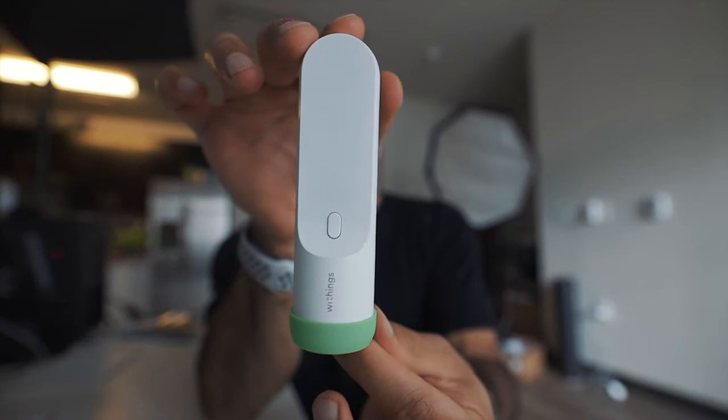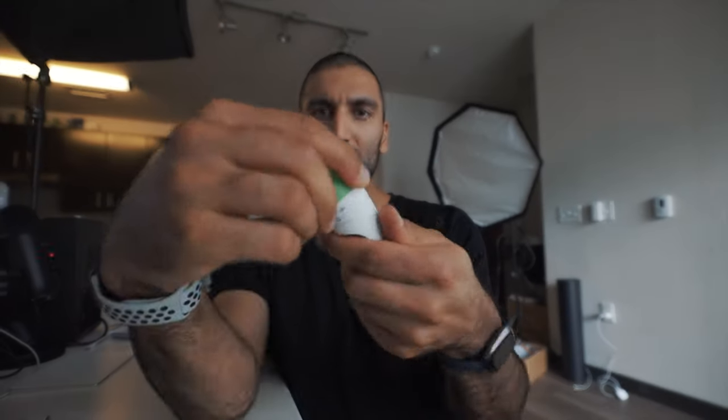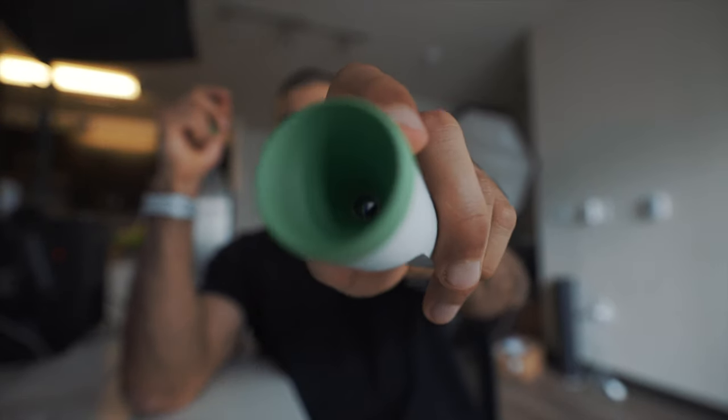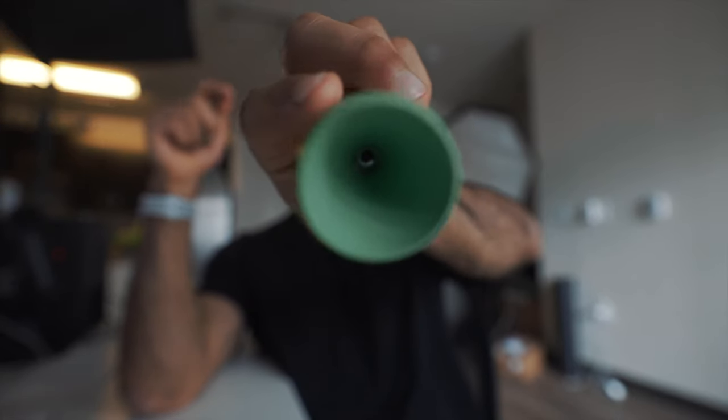It's got the green cover on it right now. Looks simple, and the green cover comes off. And then you have the sensor right there — you can see that. It's like an internal tube, actually. I thought it'd be flat, but I assume there's like a laser beam in there.